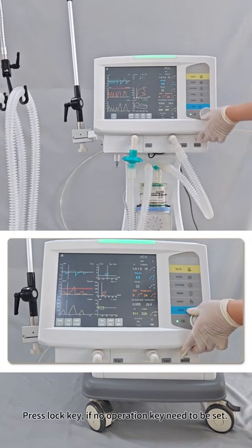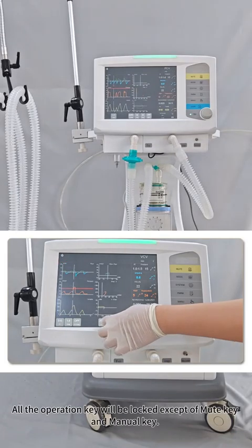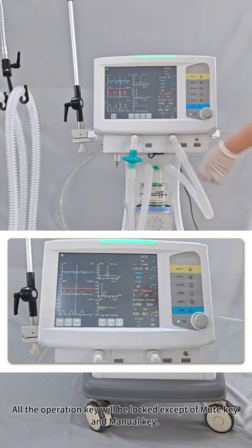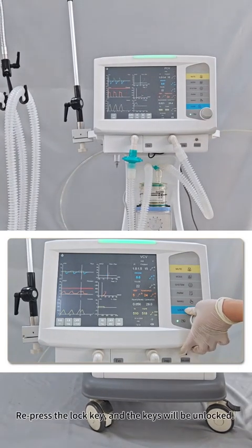Press the Lock key if no operation key needs to be set. All the operation keys will be locked except the mute key and manual key. Repress the lock key, and the keys will be unlocked.